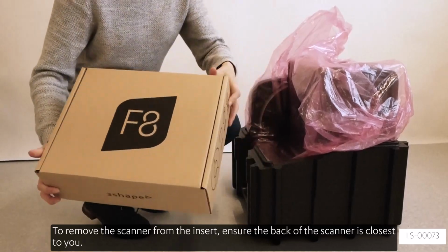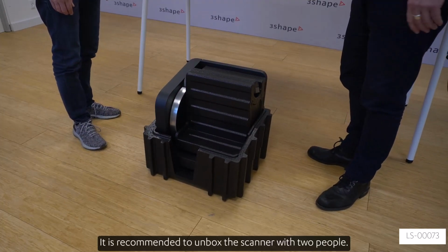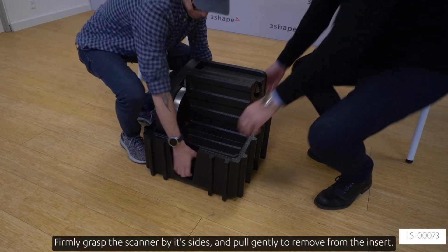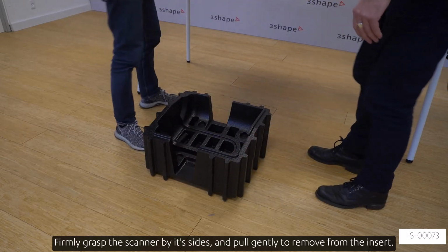To remove the scanner from the insert, ensure the back of the scanner is closest to you. It is recommended to unbox the scanner with 2 people. Firmly grasp the scanner by its sides and pull gently to remove from the insert.